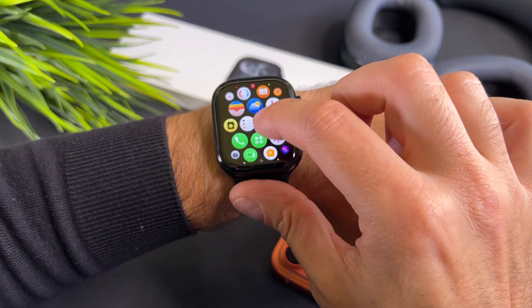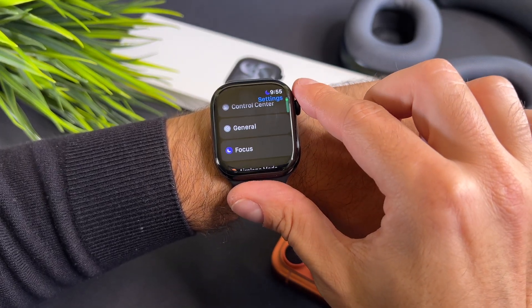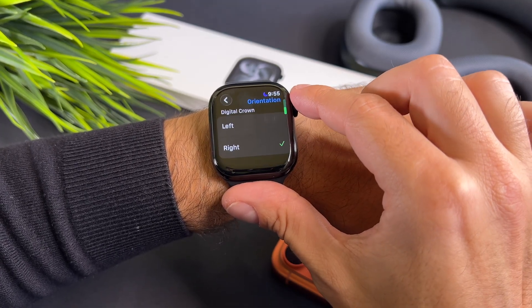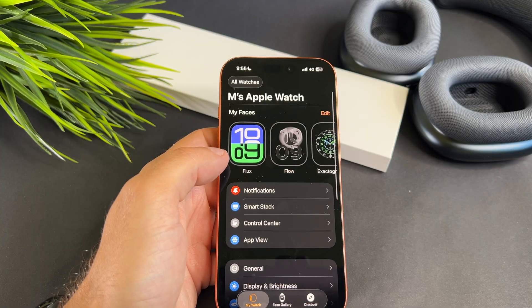Using it is super simple, but there are a few steps you need to keep in mind. First, in the Watch app on your phone, go to General and select Watch Orientation.